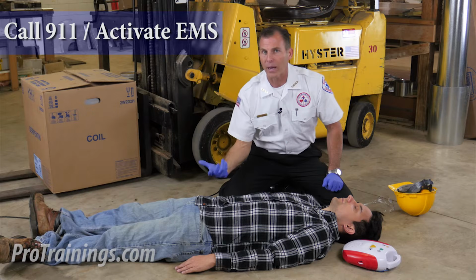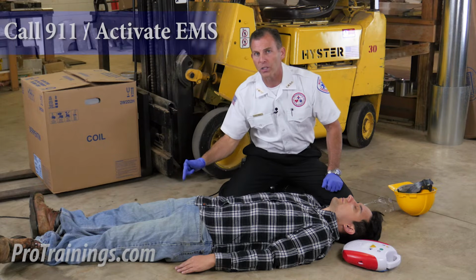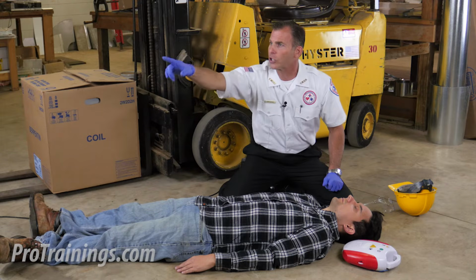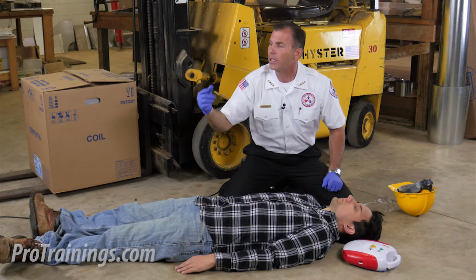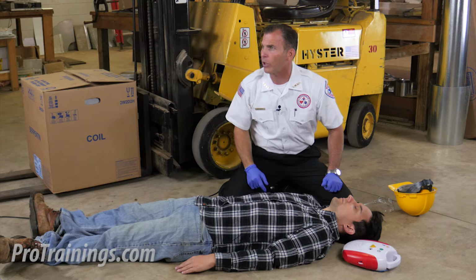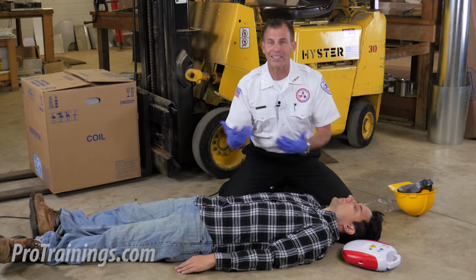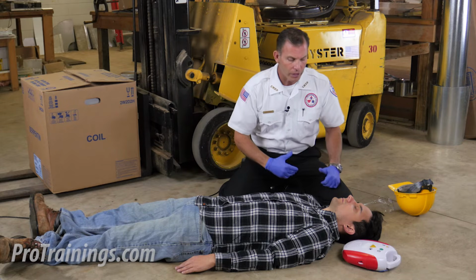I can either do that with my cell phone by dialing 911 and keep it on speakerphone, or if I've got a bystander, I can tell them, "Hey, you in the plaid shirt, go call 911 and come back. And if you can find an AED, bring it with you." Now in this case, I already have my AED with me, so that's not as big a deal. Now let's go ahead and continue.